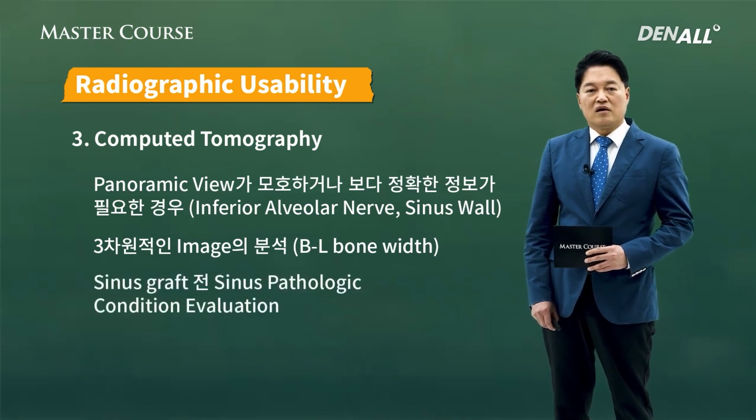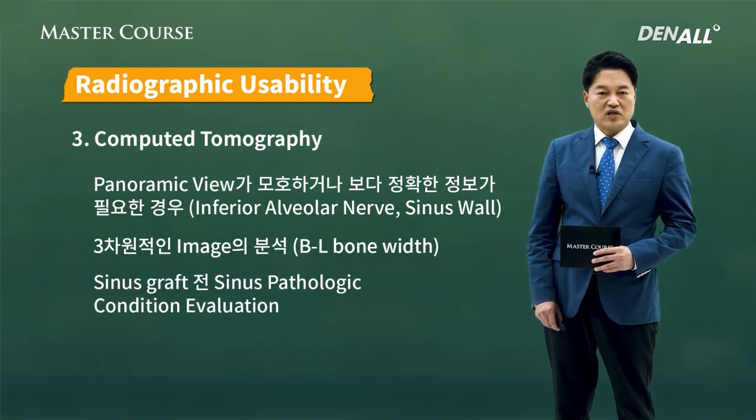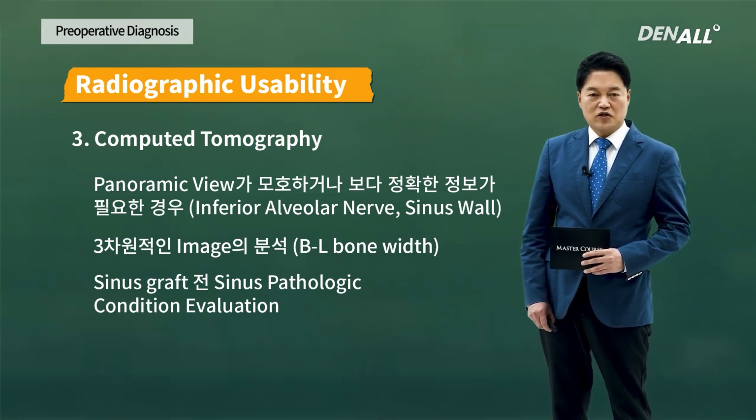For sinus surgery where bone graft is necessary, before that, you need to evaluate the sinus pathologic condition. So CT needs to be taken to have a successful sinus surgery.